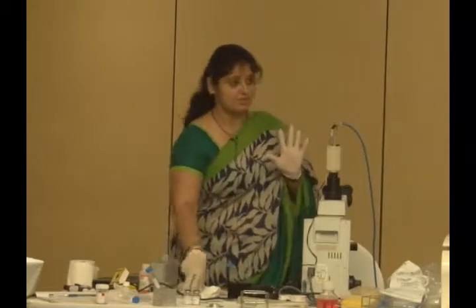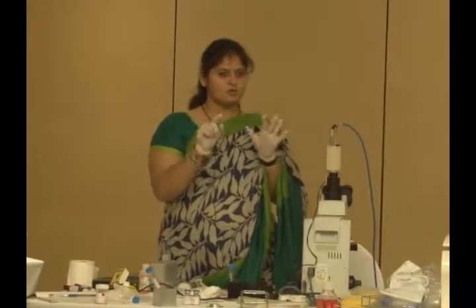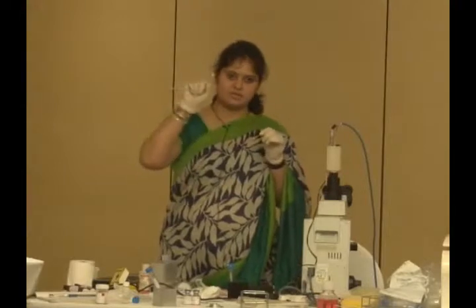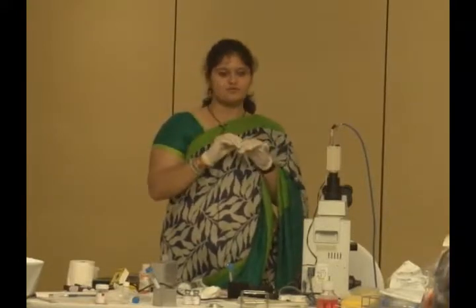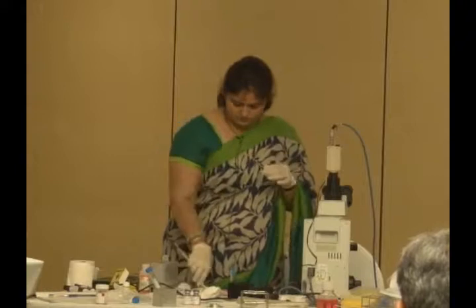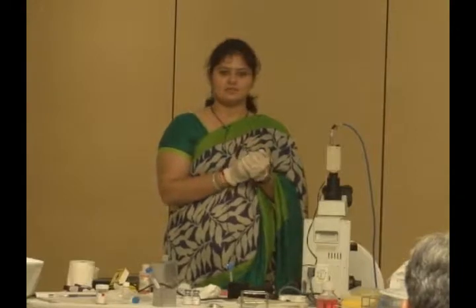Or else if you have a very good sample, you just take a drop from the top and evaluate the sample under the microscope. If you feel that the proper amount of motile sperms is present in the sample, you can take 0.5 ml of the sample from there itself and examine. So no need to centrifuge. But that is in case of very good motility. I mean, if you have 50-60% motility, in that case you can get such a good sample. Confusion or clear? Sure? Both the methods?